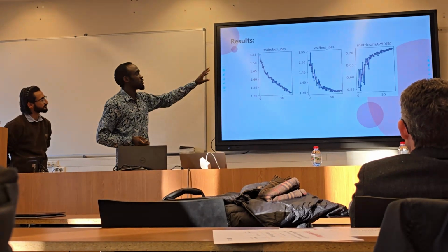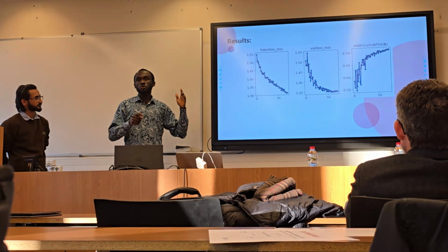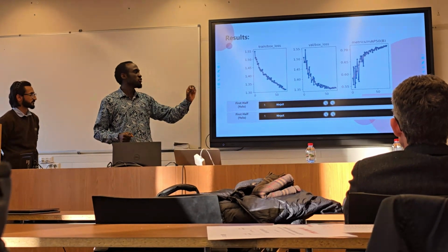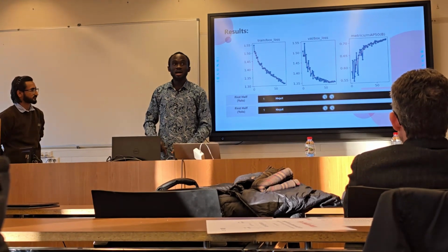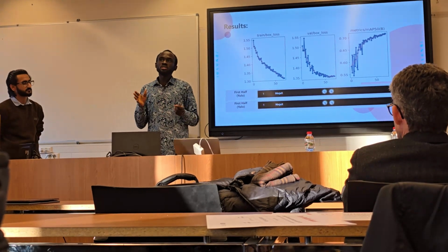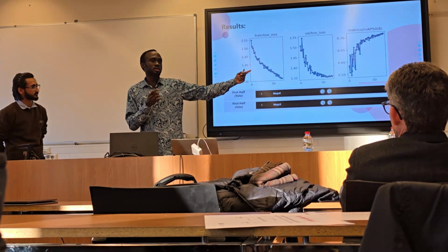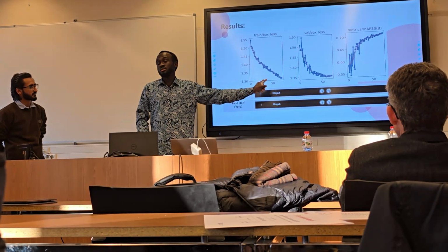Moving on to the results we obtained, this was our box loss for training and validation, and also the mAP that we got. The first result we got from the test was 66% with the best model. Then we considered how the IOU and the confidence the model has are behaving to give us this 66%.